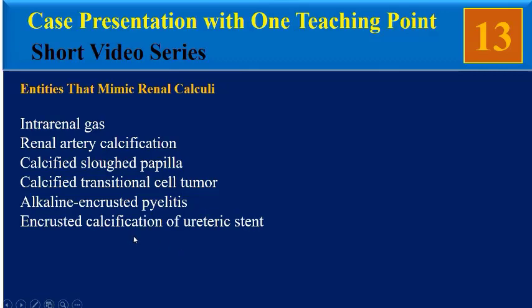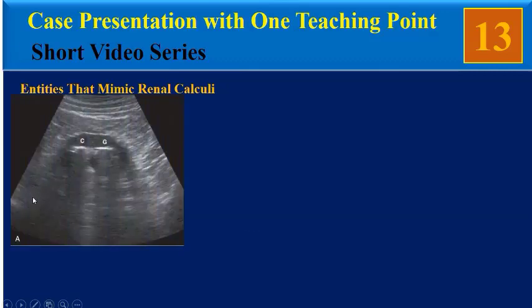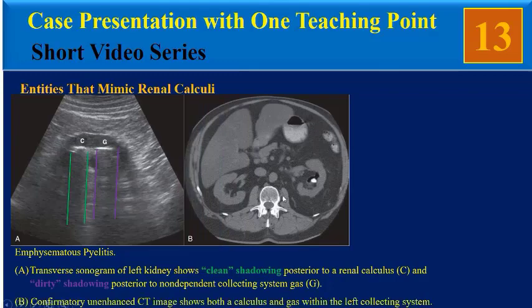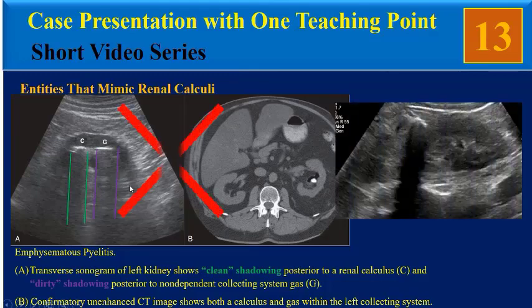The first entity is intrarenal gas. This sonogram is an example of emphysematous pyelitis. This transverse sonogram of the left kidney shows clean posterior shadowing posterior to a renal calculus and dirty shadowing posterior to non-dependent collecting system gas. A confirmatory CT scan shows both a calculus and gas within the left collecting system. Our patient is not compatible with this entity.